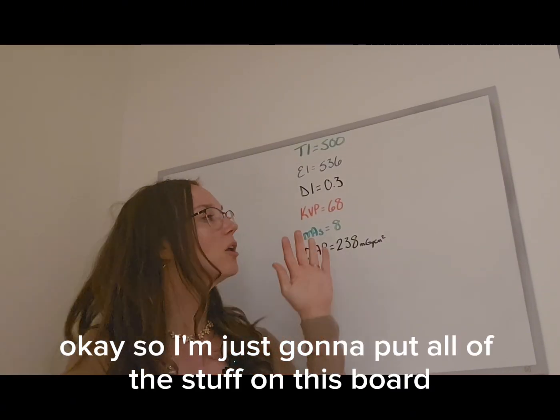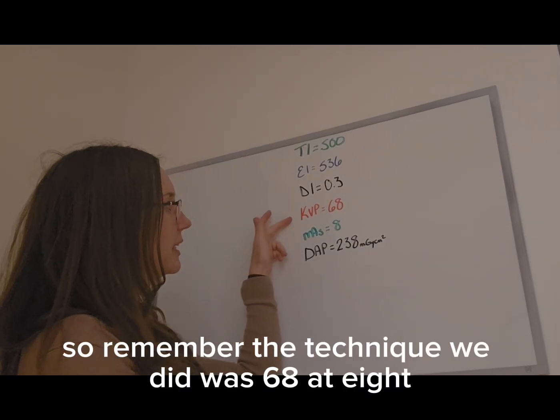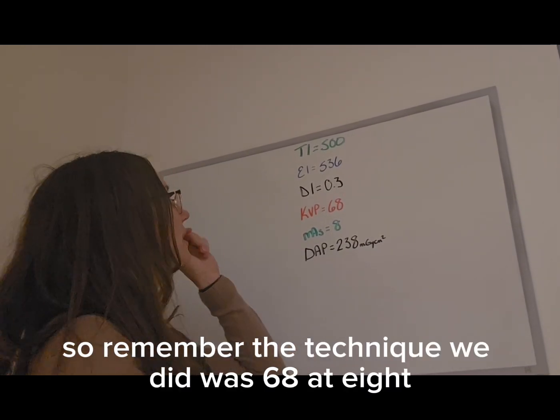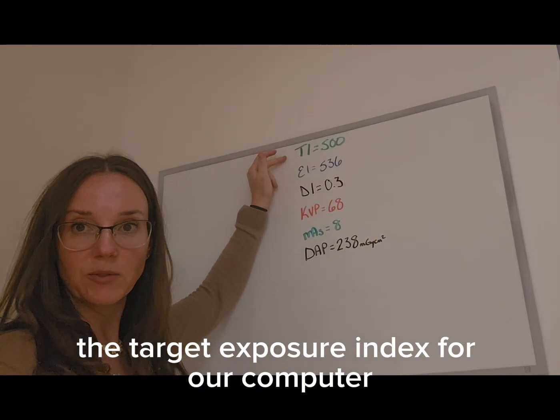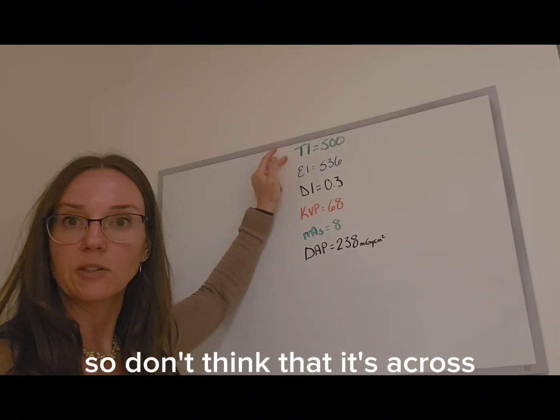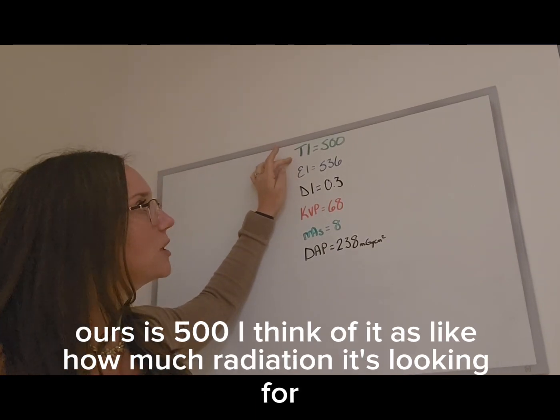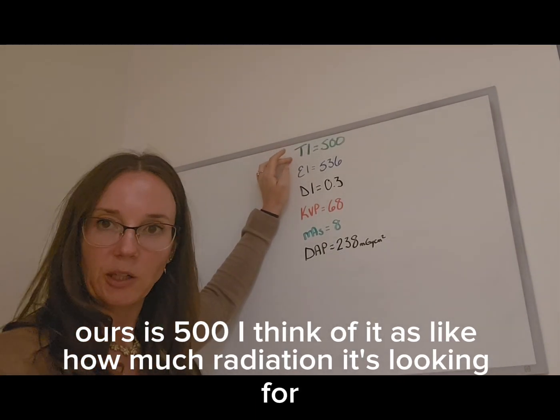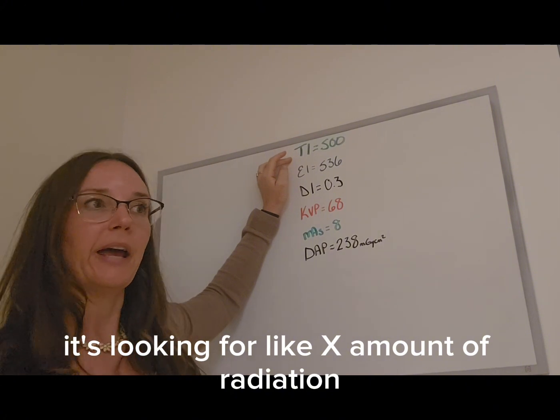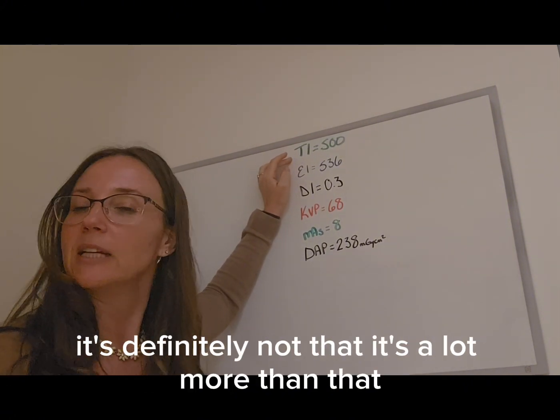Okay, so I'm just going to put all of the stuff on this board so we can kind of go over it together. So remember, the technique we did was 68 at 8. The target exposure index for our system is different across the board, so don't think that everyone needs a target exposure index of 500. Ours is 500. I think of it as how much radiation it's looking for. It's looking for X amount of radiation. In this case, it's looking for 500 units of radiation. It's definitely not that.